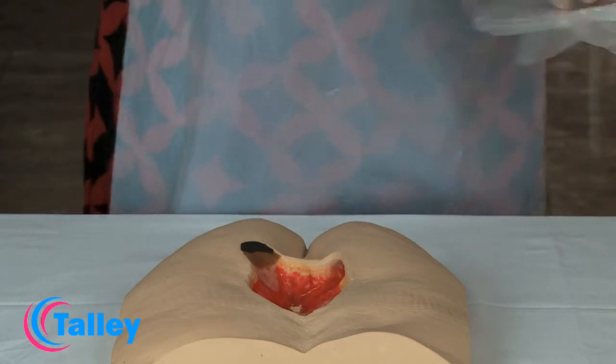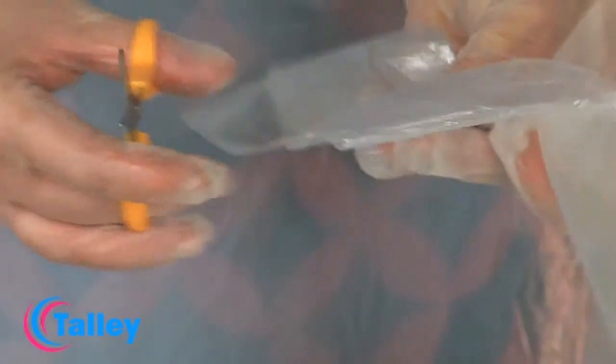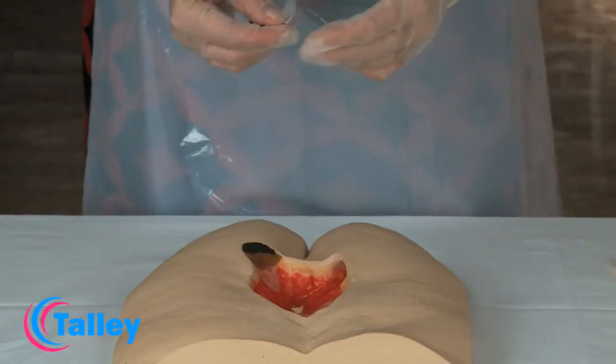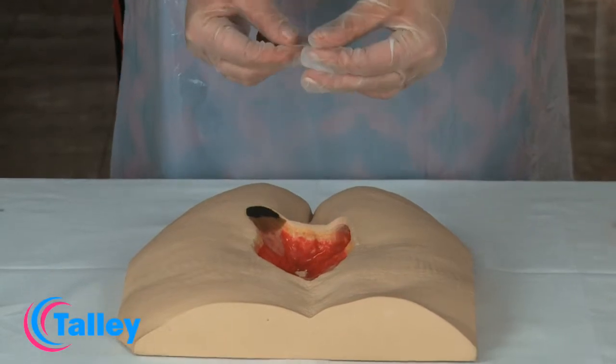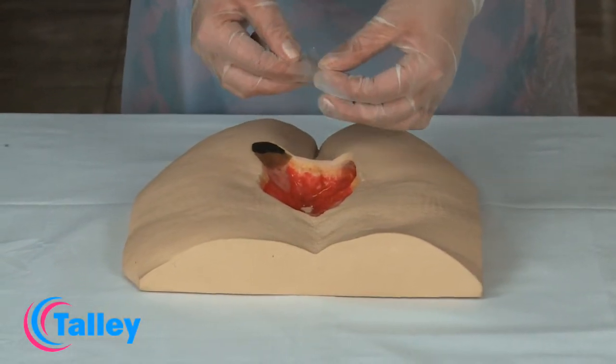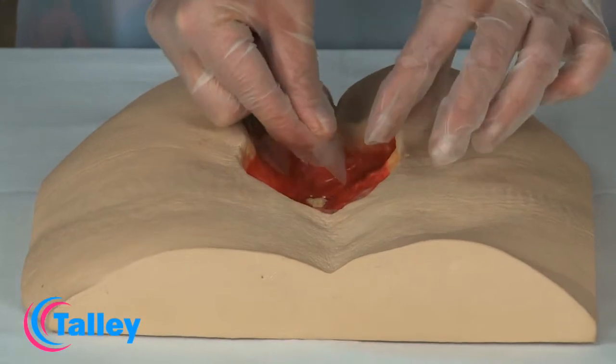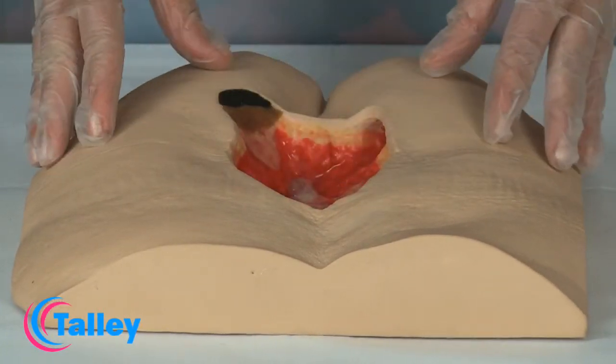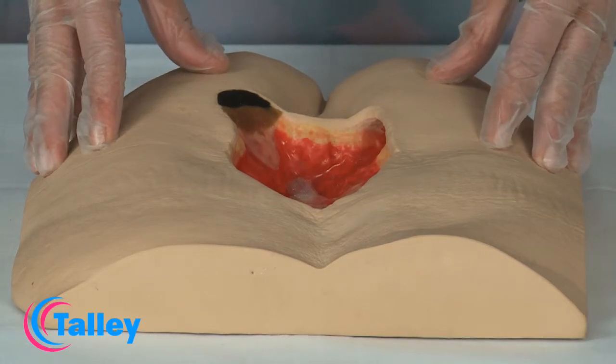Ensure that the edges of the non-adherent contact layer are within the wound margins. Any contact layer can be used — please check your local protocol or formulary. The non-adherent contact layer should be cut to size to cover the underlying structure and placed gently in the wound.